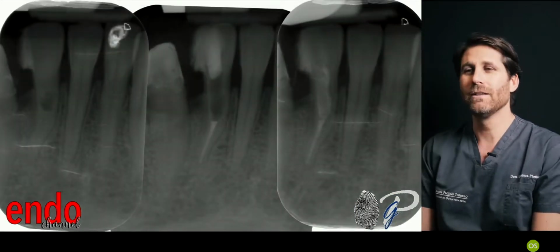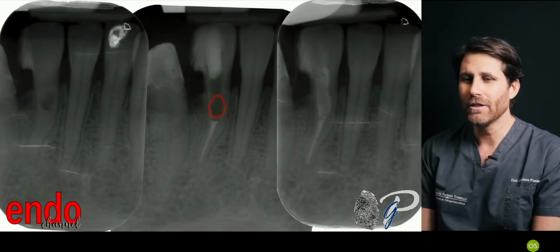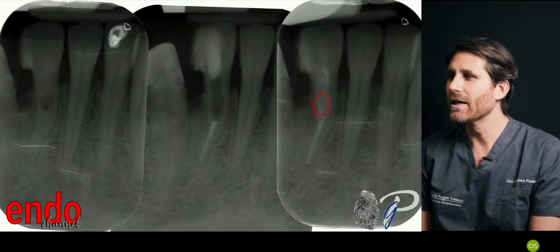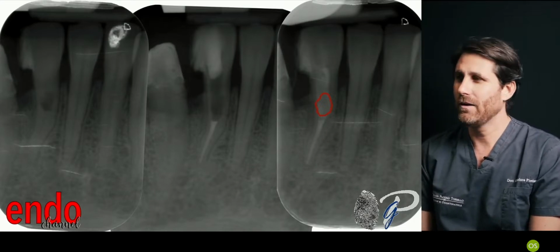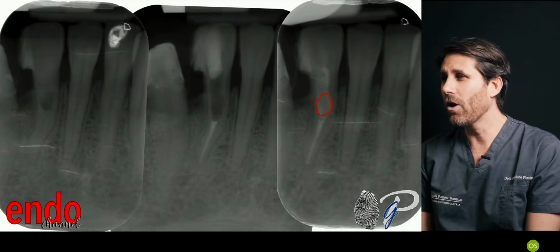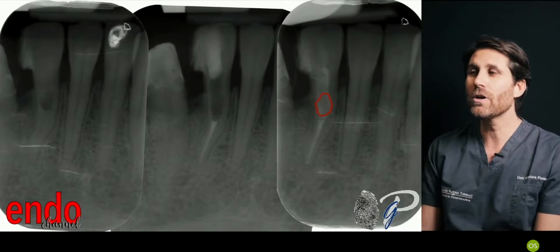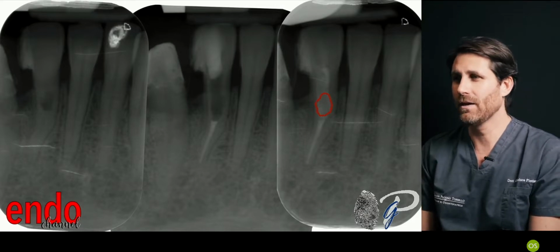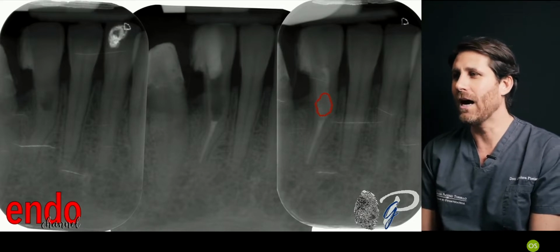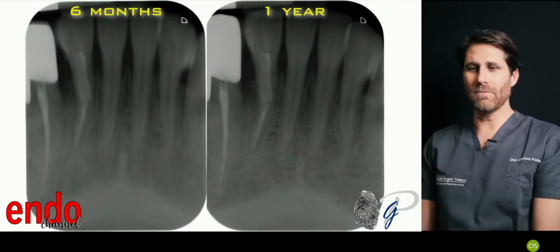If you see the outline of the internal resorption before and after and on the restoration, the internal resorption was the only thing that we have removed, and coronal to the internal resorption, we had the need to remove that structure to clean the internal resorption and to find the canal apically. And these are the controls at 6 months and 1 year.